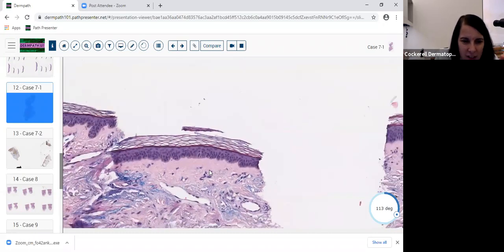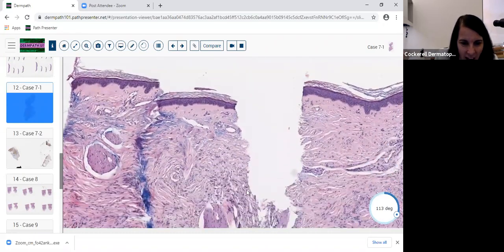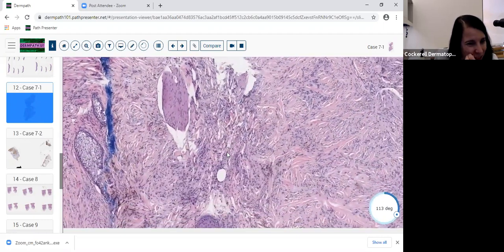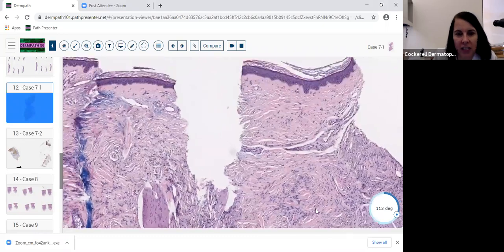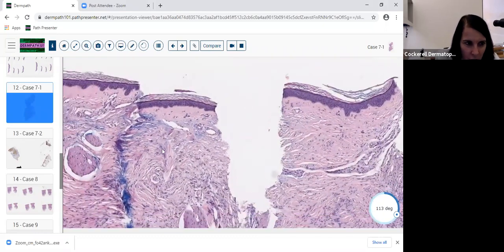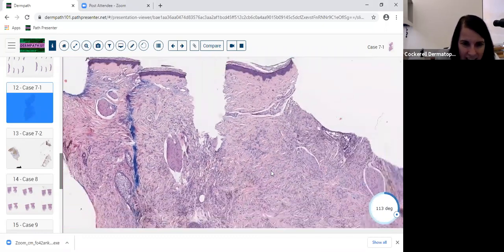If you start seeing mitoses in this thing and the ratios are kind of high and you do see the dendritic cells and you're thinking about a blue nevus because you see those dendritic cells, don't go off the rails and call it malignant melanoma. Look for the intraepidermal component before you go off doing that, because on the board, they like you to overcall.